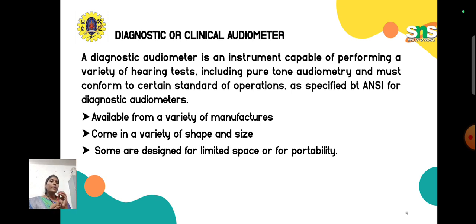This particular audiometer is a highly accurate device. It should comply with some standards before being set up in the market or in a hospital. Because we are going to apply it on patients, and based on the readings given by the device we go for treatment, there should not be even a minute error or problem.